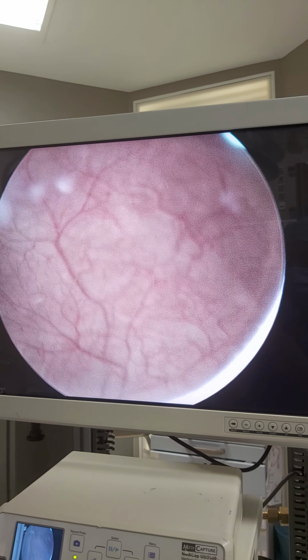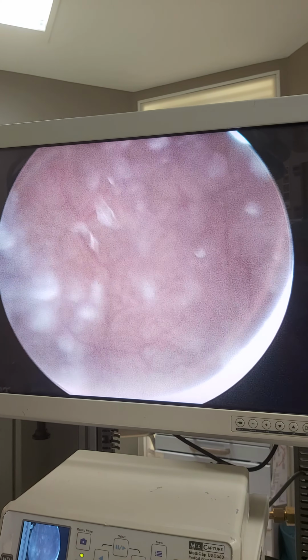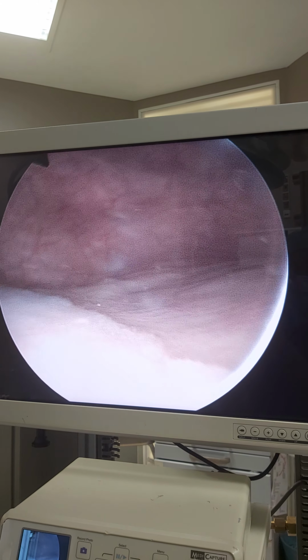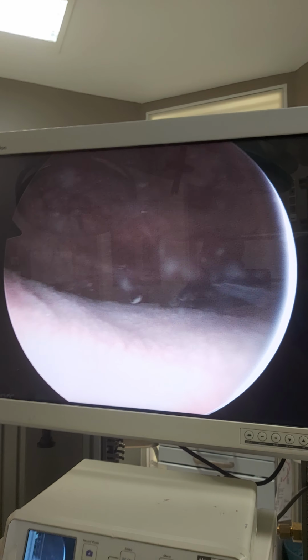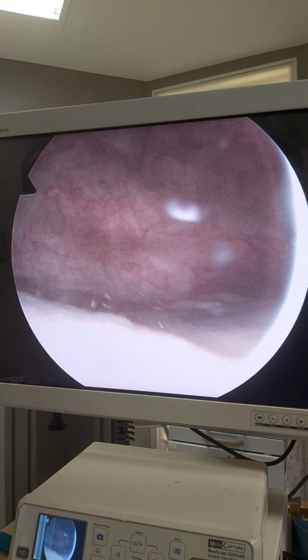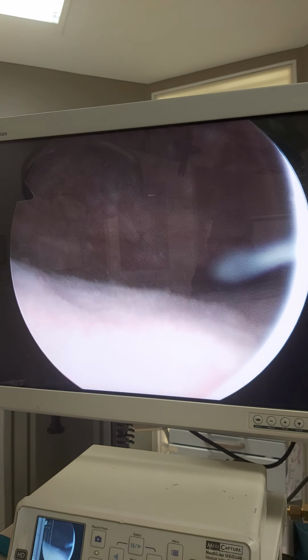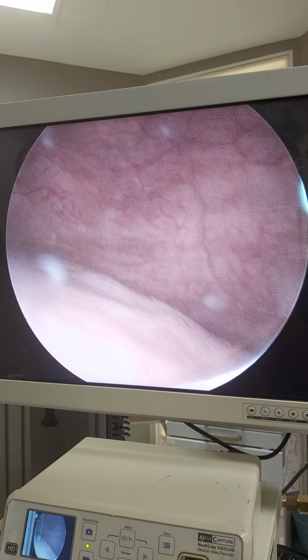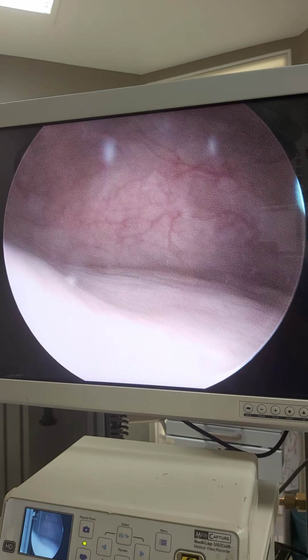Okay, here we see floating infected particles, and here a real very abundant leukoplakia tissues. In most of the countries other than United States and UK, we see these abundant tissues. These people do not treat it with long-term antibiotics too much.